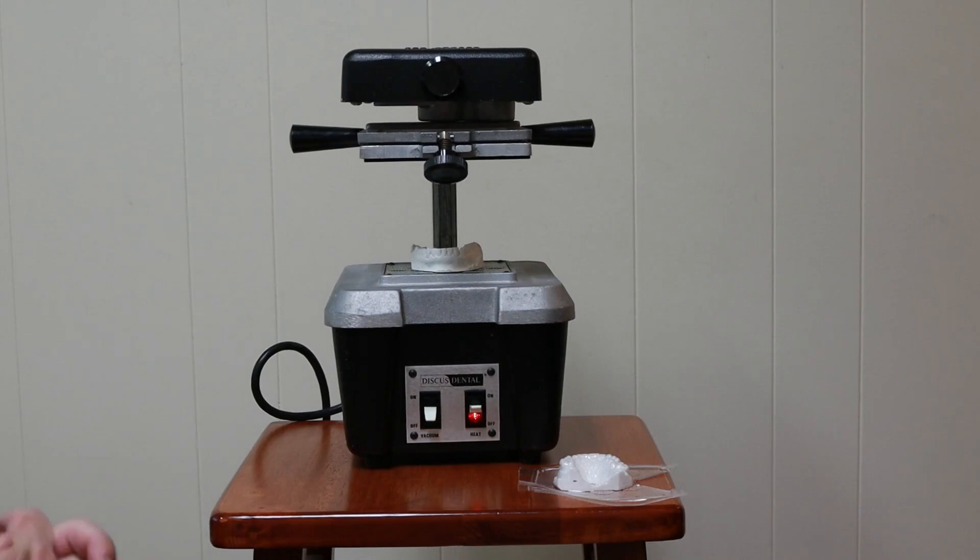My vacuum forming machine is an older model. I probably bought it 20 something years ago. It's labeled a Discus Dental brand, which I don't think is around anymore. They got bought out by somebody. They used to make bleaching products, white bleaching gels, and all the products associated with whitening, including vacuum forming machines.